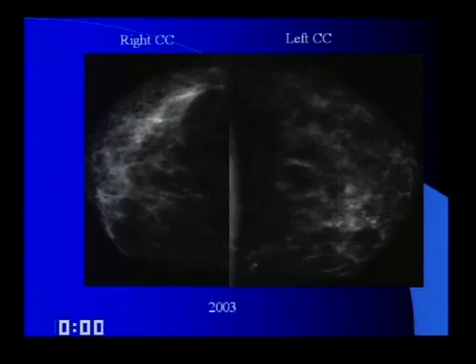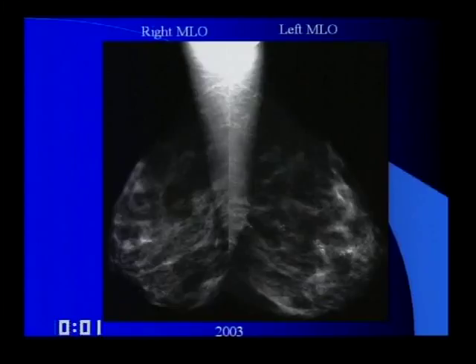In the left inner quadrants, there are calcifications extending posteriorly, almost in a lobular distribution. Okay. The calcifications look pleomorphic. Some of them are coarse, but they'd be worrisome for malignant calcifications. I would do additional views, perhaps spot compression, just to characterize the calcifications.